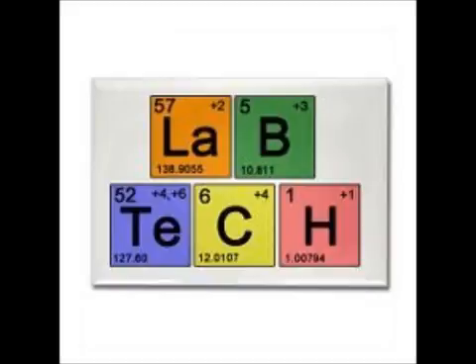So the key things with aggregation, I'm going to flag the ones you got to know, and it'll be a matching. You don't have to draw any curves. You are going to have to know which are monophasic and which are biphasic. And so we're going to go over that. Some are such strong aggregators that they cause that release reaction and you can't even tell. It just goes one straight line, and that's monophasic.